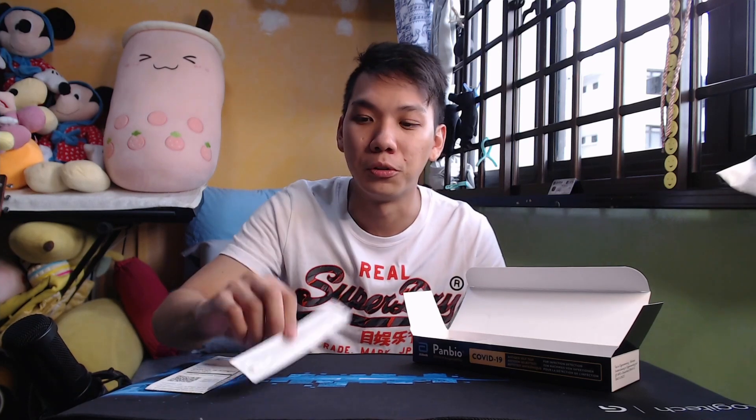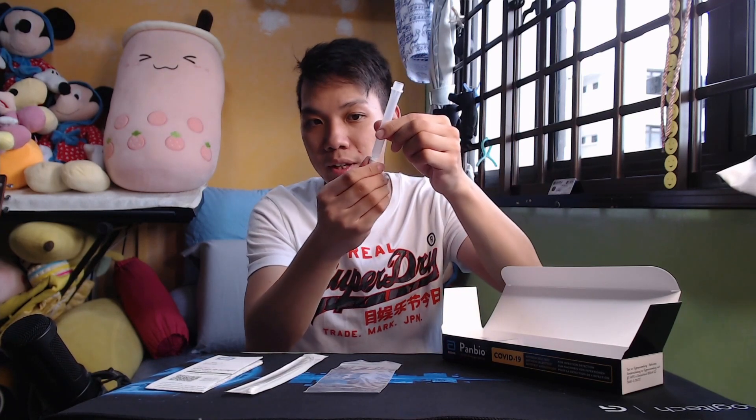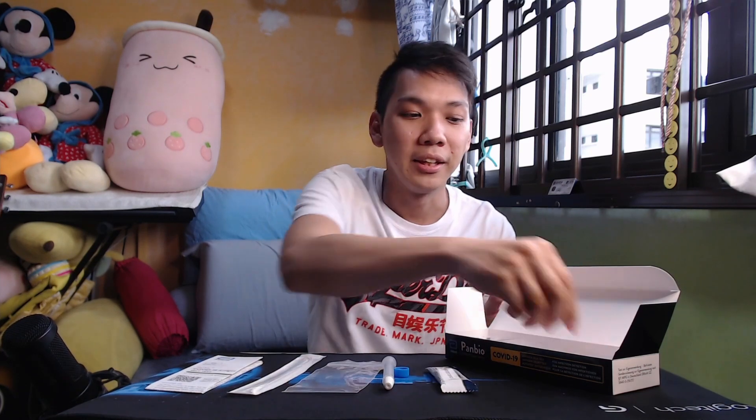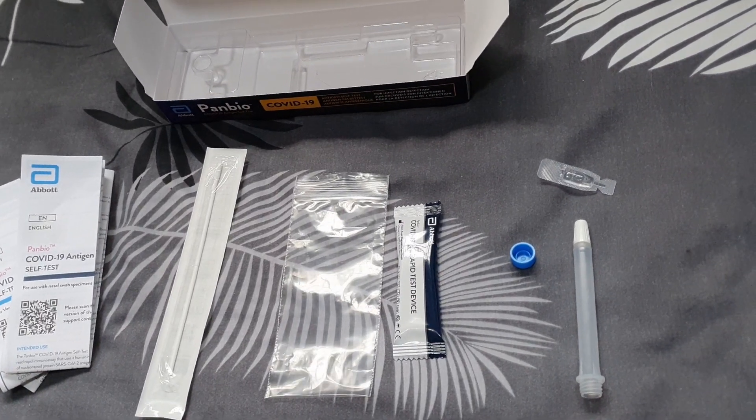Inside the rest of the contents, you'll find the swab — this is the device that will go up your nose. There's a zip-lock bag for you to throw everything away after you're done. Then there's the tube — I'll call it the white tube, it's like a test tube — which comes with a cap you can open. There's also a blue cap to cover the tube. This is the ART device — the most important one, be careful with this, it comes sealed. And last but not least, there's what I like to call the eye drop — this is the liquid buffer bottle. Please don't put it in your eyes — this is the liquid you'll be dipping in later.